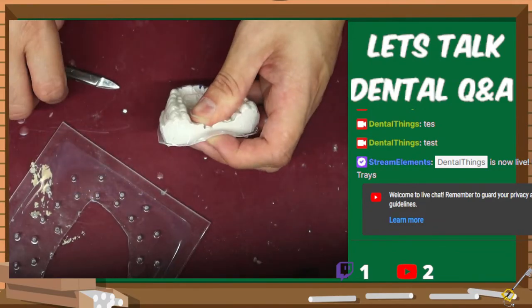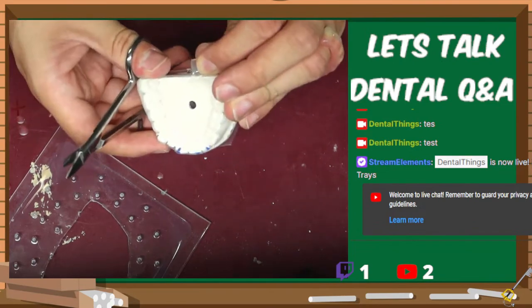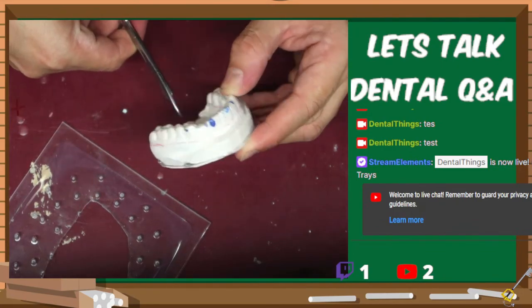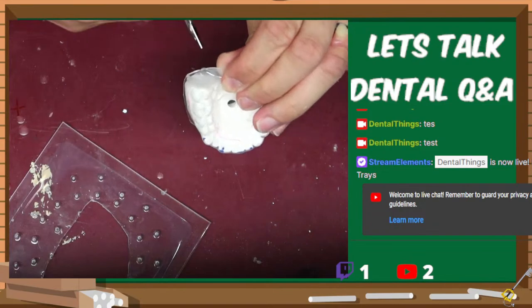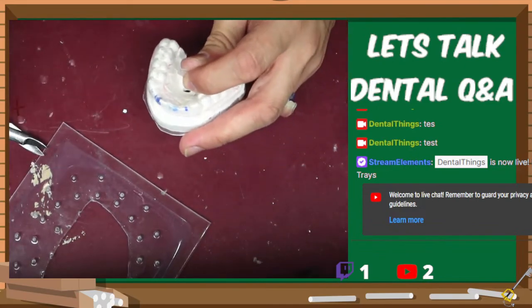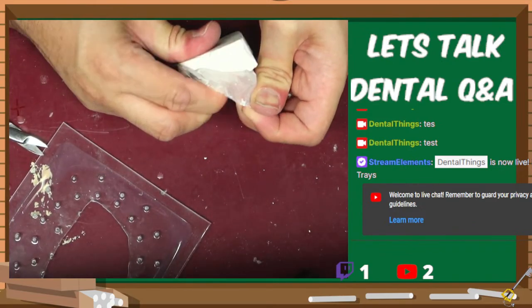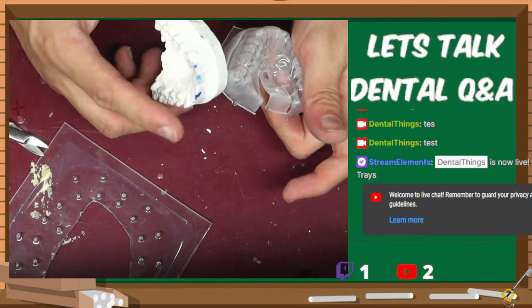So I'm just gonna go and make a cut right here in the back so I have a little bit of relief, because nothing's going on right back here. This is the palate, and nothing goes on the palate unless you're making a denture. Once I relieve it from this little area, I'll have tons of room to go and peel this off from the side. Same thing over here. Just go cut that side. And from that point, I can just go and peel this off a little bit nicer. And good if it doesn't break the model, so I can reuse the model again if I need to.